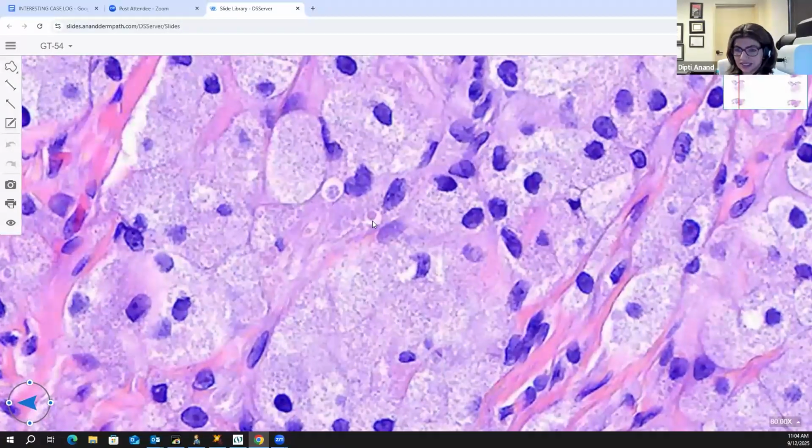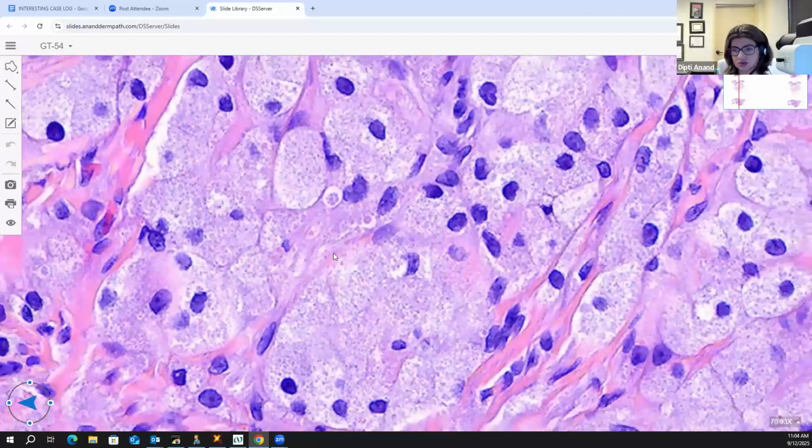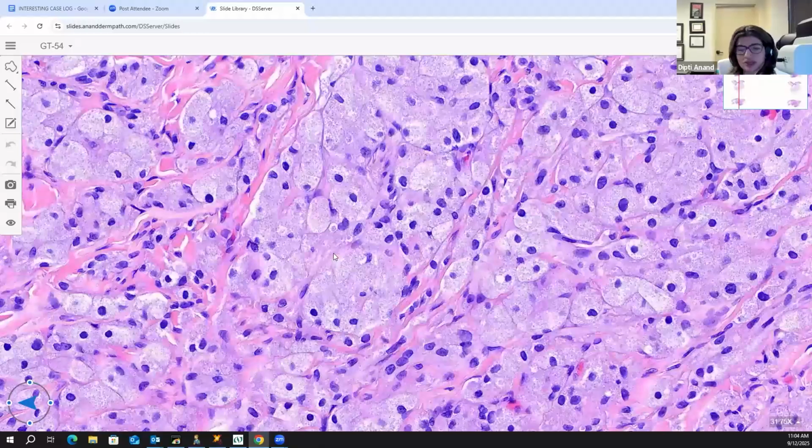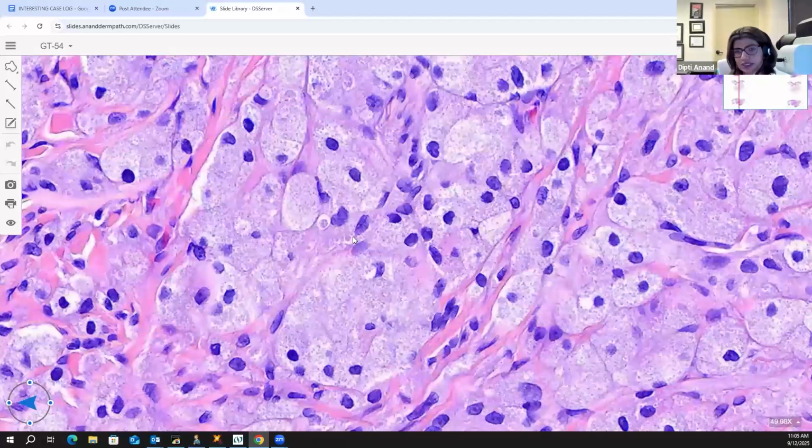So these pink inclusions are what you're looking for. Each granule is a lysosome in arrested development within a Schwannian cell. So these are S100 and CD68 positive because they have dual histiocytic and Schwannian lineage, but basically Schwannian lineage. The lysosomes are the granules, and you can see the nice pustulo-ovoid bodies of Milian.